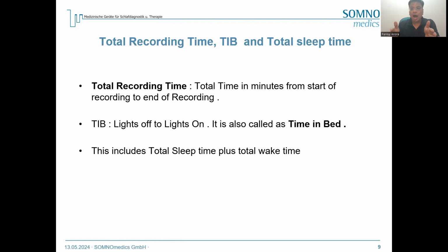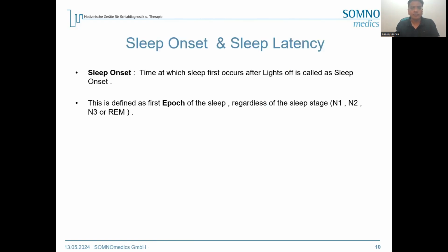And we want to know how much time he has slept between lights off and lights on. That is called total sleep time. He has slept between lights off and lights on. So now what is sleep onset and sleep latency?